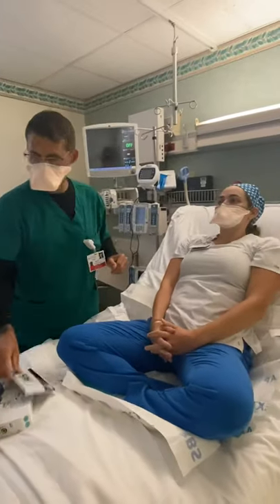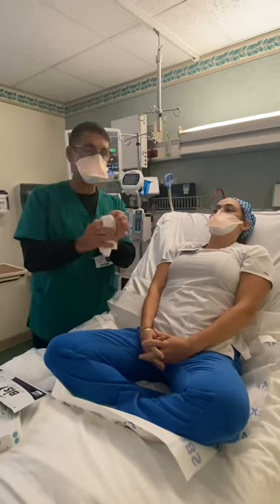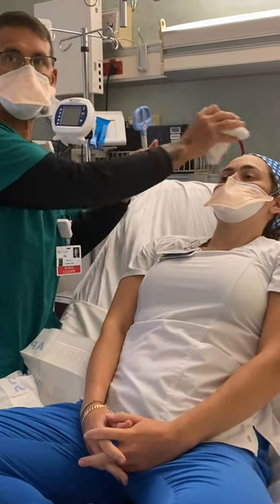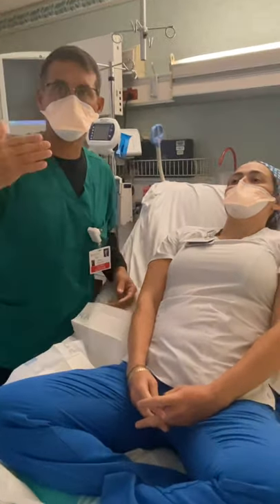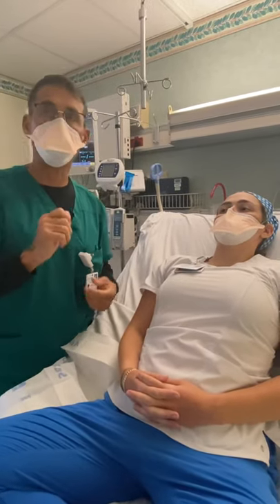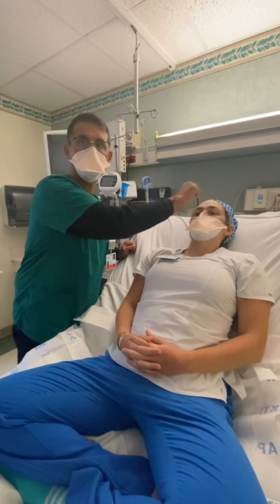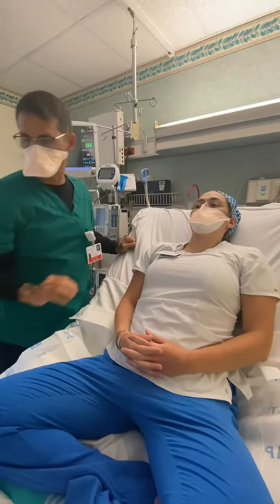The first thing you're going to do is take some soapy rag and wash the forehead with soapy water, and make sure that you dry it really good. Then you're going to take some alcohol wipes, and I don't have any alcohol wipes, but you're going to wipe the entire skin with alcohol, and let that dry.